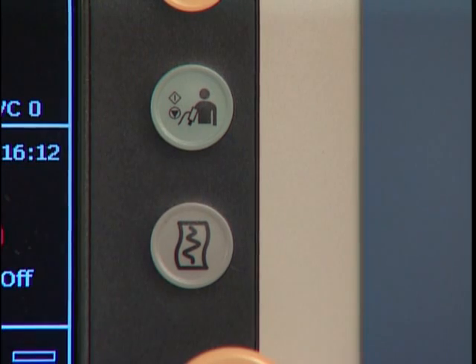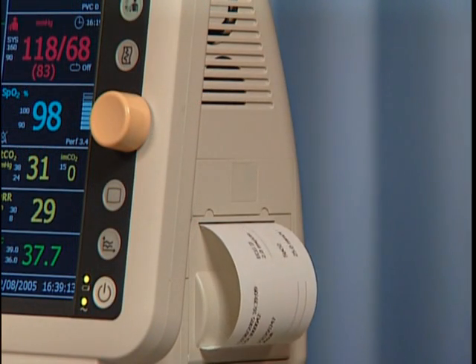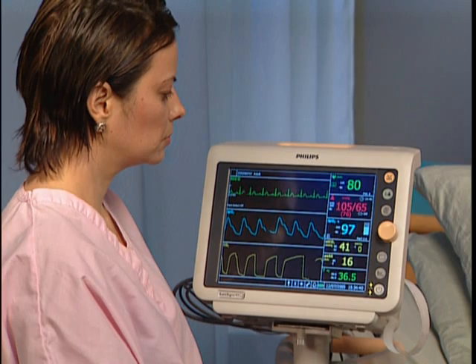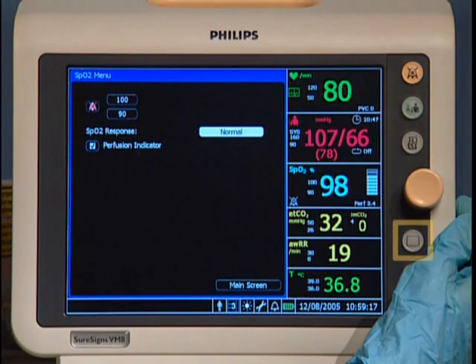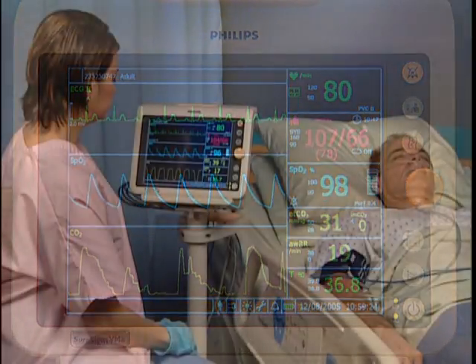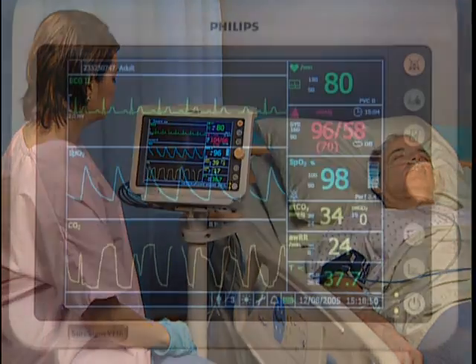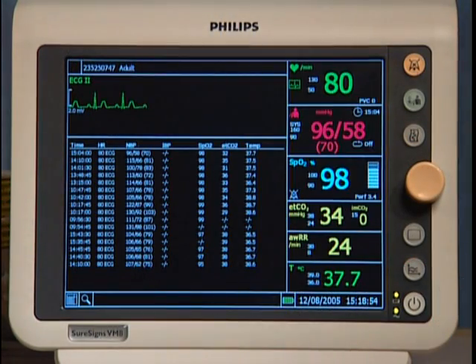Press the Recorder button to produce a printout of patient data. The information provided on the printout is based on the type of data currently displayed on the screen. This is the main screen button — press it to exit a menu and return to normal monitoring mode. Any changes made before exiting the screen are saved. Pressing the Trend button displays stored patient vital signs.